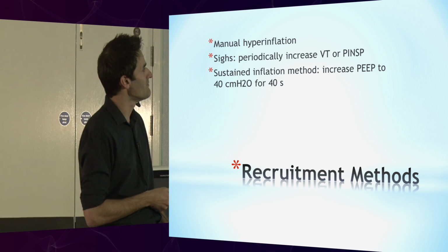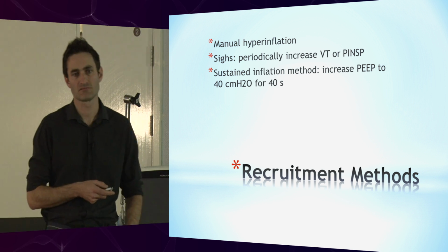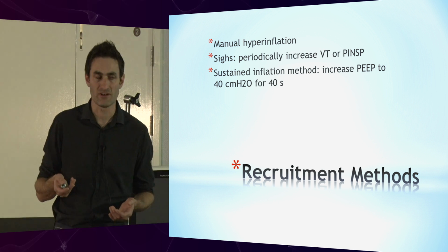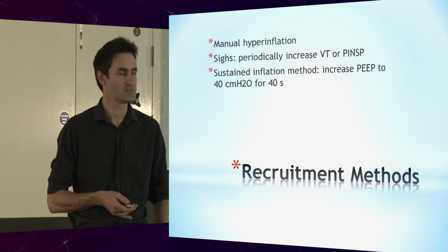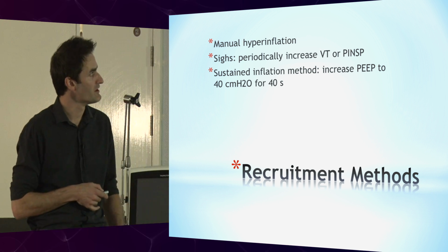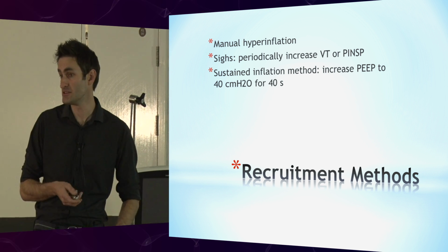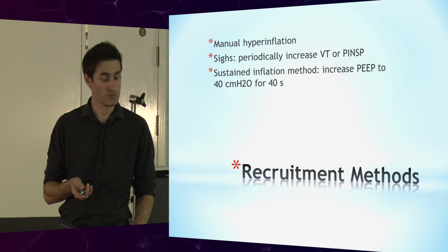Okay. I don't have any experience with this technique of using sigh, where you periodically increase tidal ventilation or inspired pressures. I'm not really familiar with that. I've never used it. What we're going to talk about here is the sustained inflation method using the PV tool. Okay, and hopefully we'll be finished shortly.